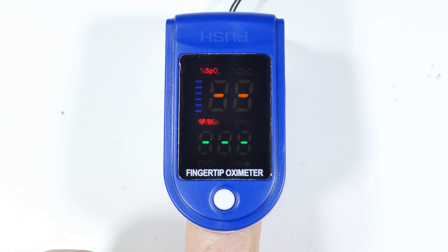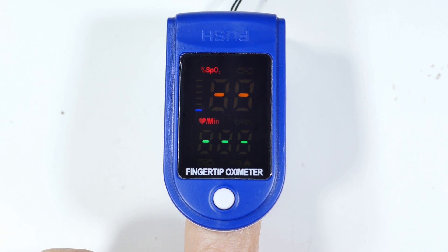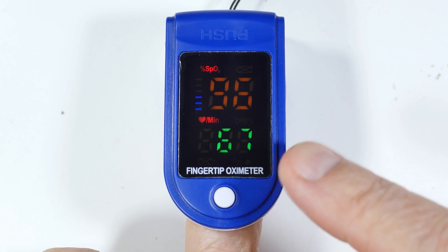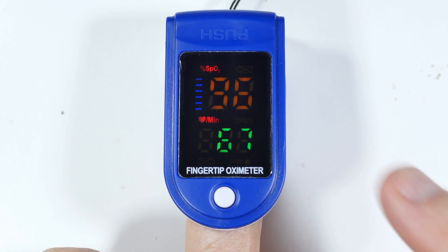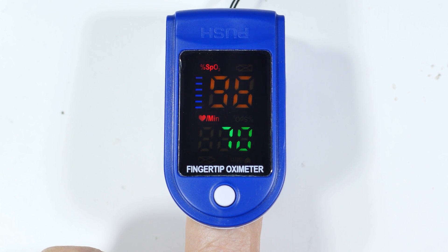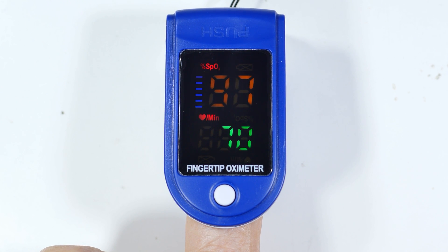We took this to the hospital tonight — my son had to get a tetanus shot. We put this on one of his fingers and on the other finger right next to it the hospital put on their high-dollar fancy oximeter, and it was only off by one percent, which is not too terrible for something that's cheap.